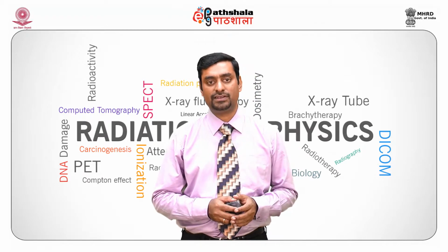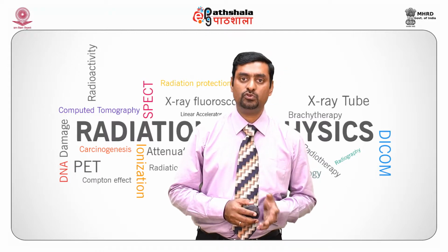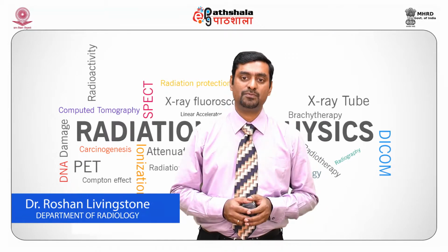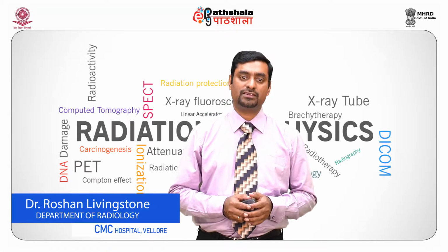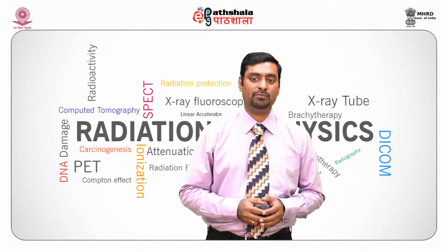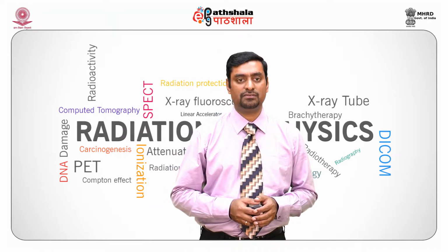In these machines, tungsten or tungsten rhenium anode can be used to withstand high heating. A choice of 3 filters such as molybdenum, rhodium or aluminum is present in the slot scan scanner. Typically, higher tube voltages of 31 kVp are used compared to the molybdenum or rhodium target tubes.